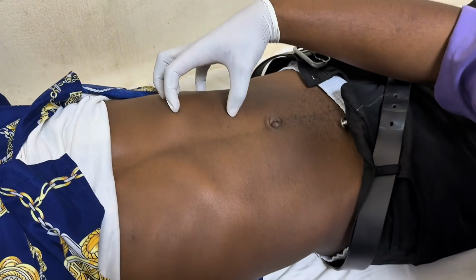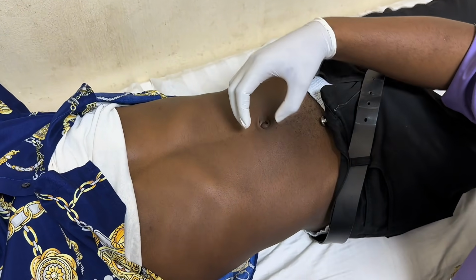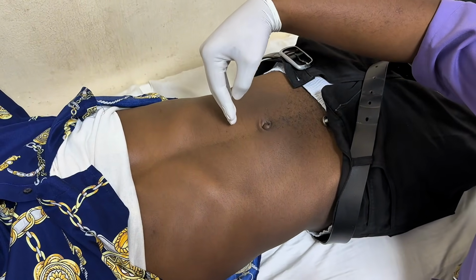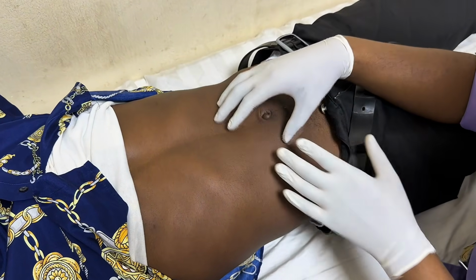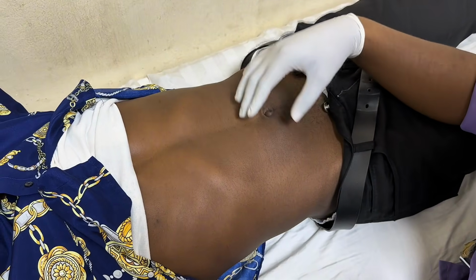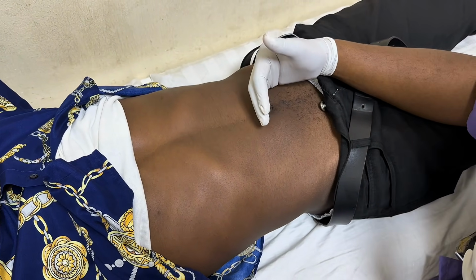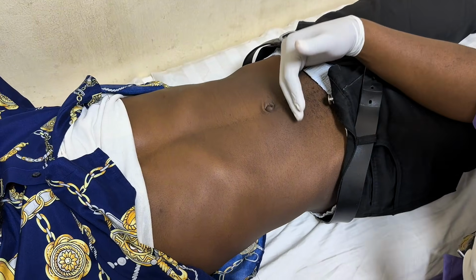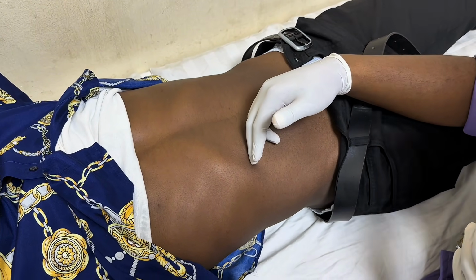And thirdly, another thing I want to mention is that once we start from the stomach around this region and we get to the duodenum, it's always very difficult to differentiate the jejunum and the ileum. So we just categorize both of them as one, and then we assess them together. Just know that the jejunum is upward, and the ileum should be a little bit downwards towards the region of the terminal ileum where it connects to the ascending colon.